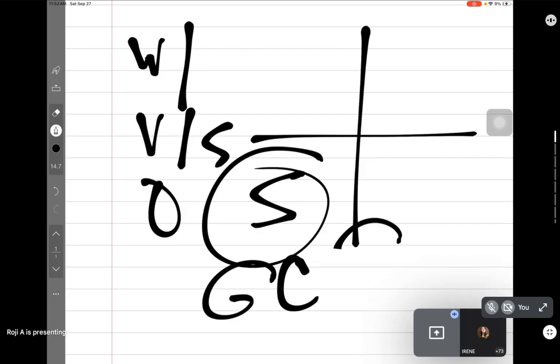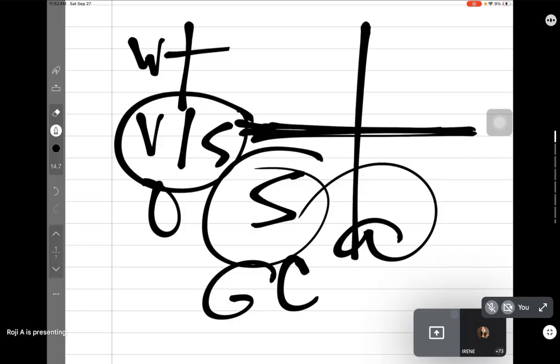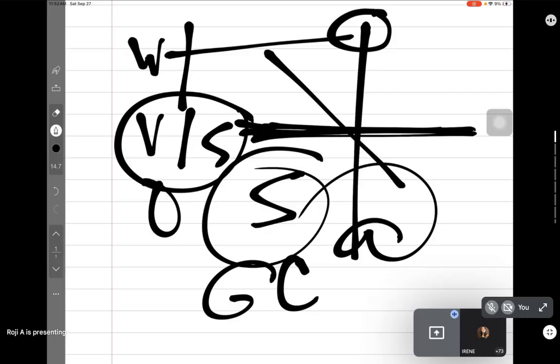Where it's at is your determining factor. If it's horizontal, this is against. If it's vertical, this is with. If it's oblique, then it's oblique.